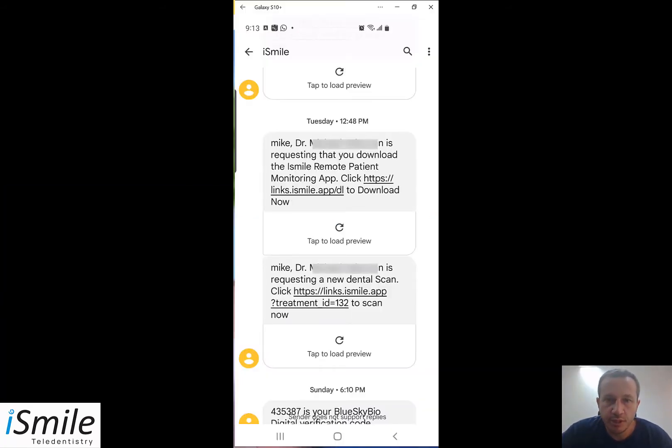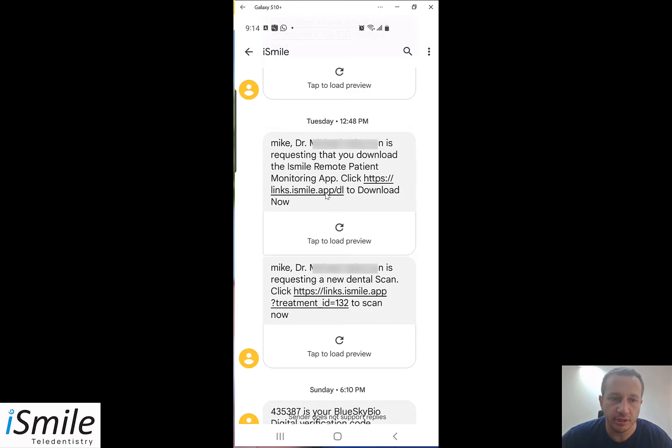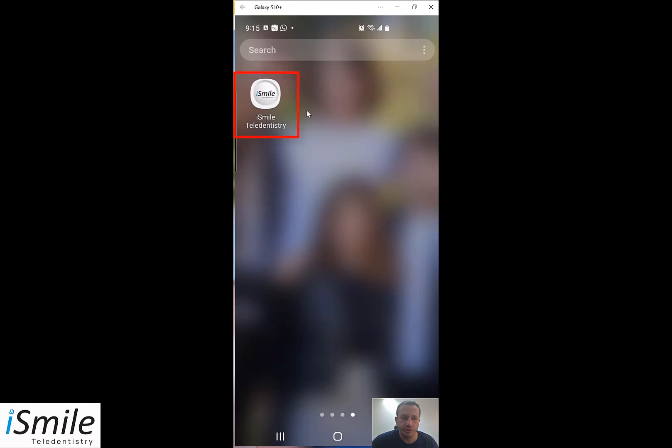In addition to the physical scope that you received from your dentist, you have received two text messages which also arrive as email. The first text message — I'm casting my phone to my computer so you can see the messages that came to my cell phone — is a request to download the iSmile app. Click on the link and it will bring you to download the app from the app store. This only needs to be done before the first time you use the app. Click install to download and install the app. Once installed, you will see the iSmile Tel Dentistry app on your cell phone.